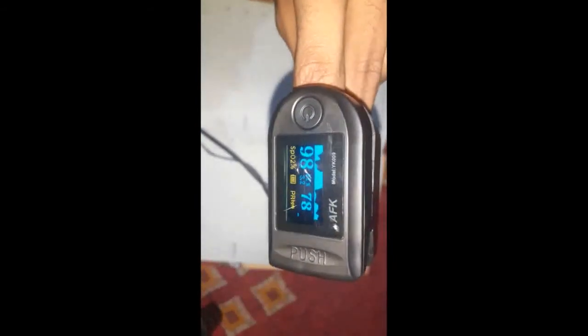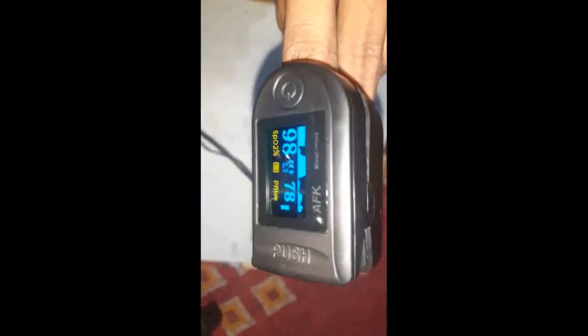Another thing you are able to see is PI. PI means perfusion index. You can see PI here.